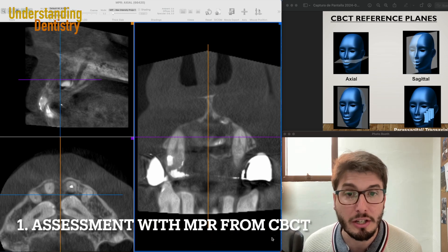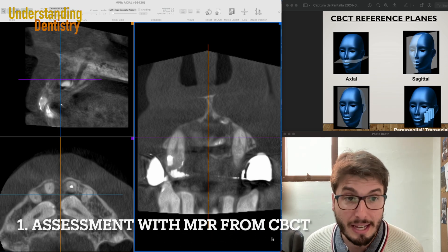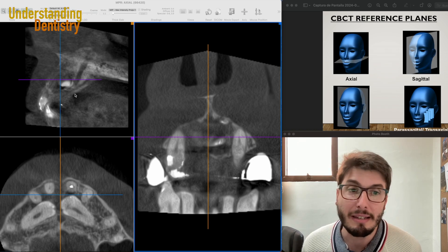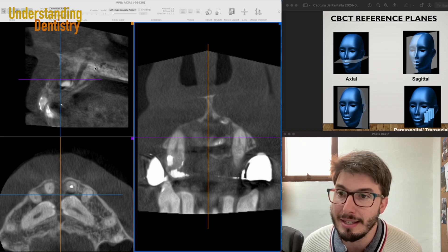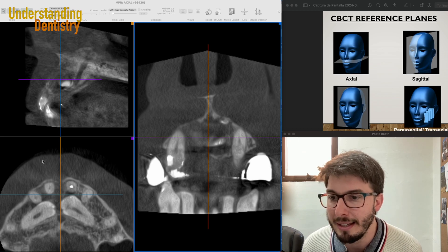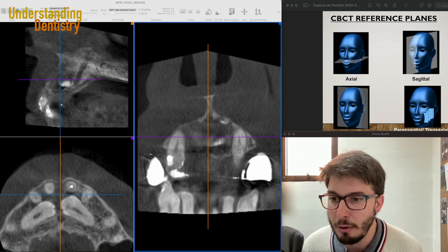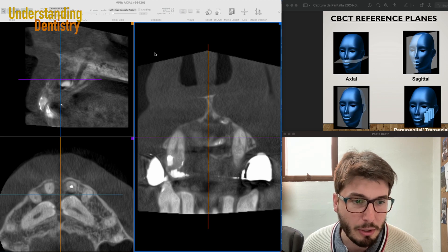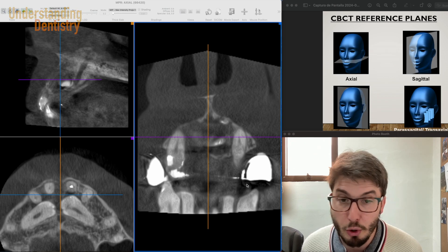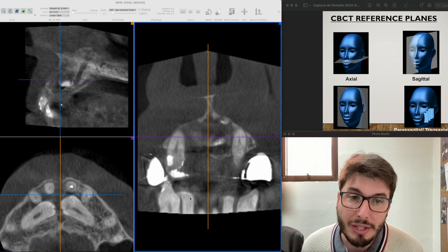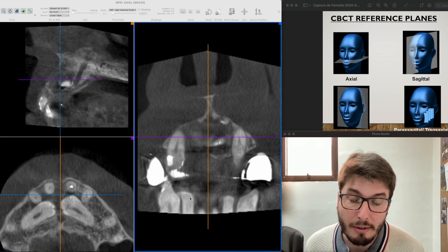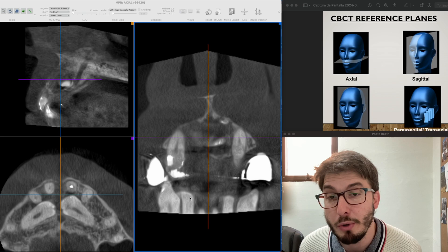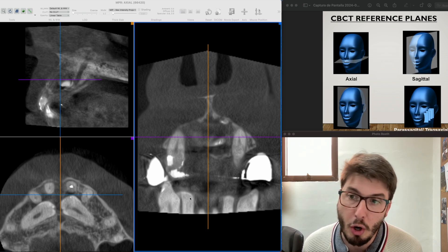We have here a challenging case with a CBCT scan, and you are seeing the three orthogonal planes. To remind you: this is the sagittal plane, this is the axial plane on the bottom left of my screen, and in the middle we have the coronal plane. I'm going to tilt and angle those planes to be parallel to the structures that we want to assess, as we should always do.